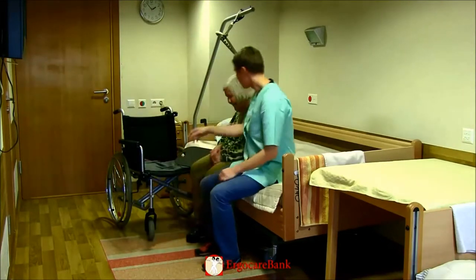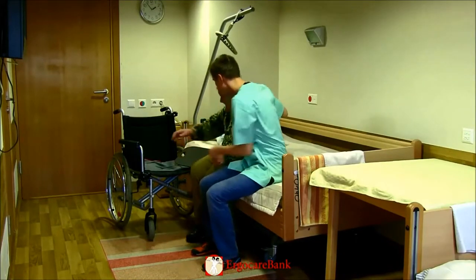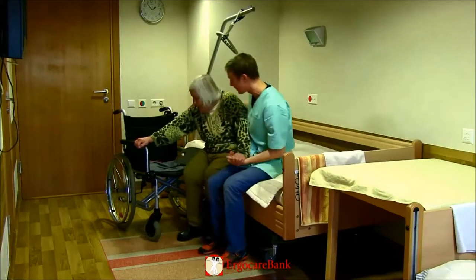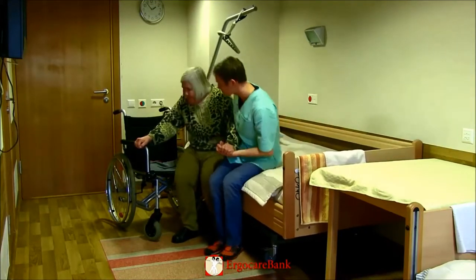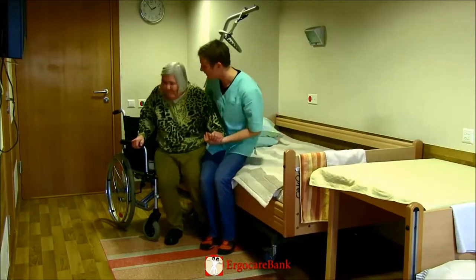He then sits down closely to Christina and holds her closest hand while she grabs hold of the far armrest of the chair. While having his arm around Christina's upper back, they lean forwards and move sideways together.